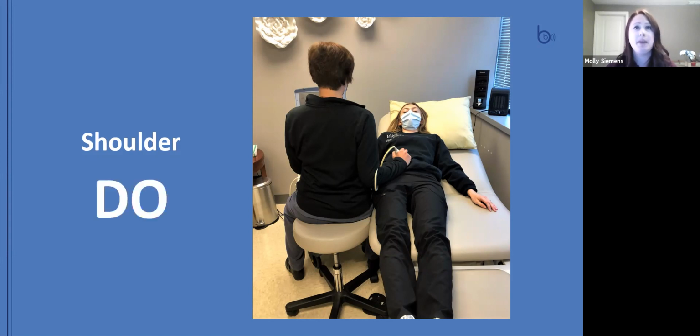Depending on the type of exam we are performing or a patient's body habitus, standing to scan may be a better option to reduce the angle of our arm. As a last-ditch effort, if available, try standing on a low but widely based step stool in order to get the height that you need in order to reduce the height of your arm.